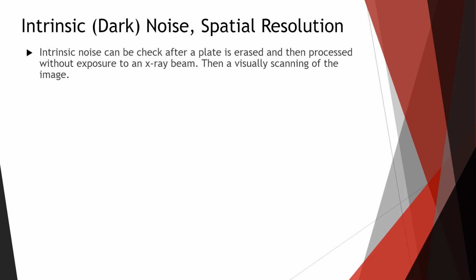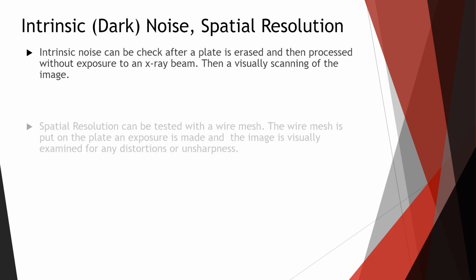Okay, but if there's a dark spot, it may be a dead detector element, or it may be something else going on. If there's a whole line of black, it could be the readout lines, there's something wrong with them. The detector may need to be replaced at that point.